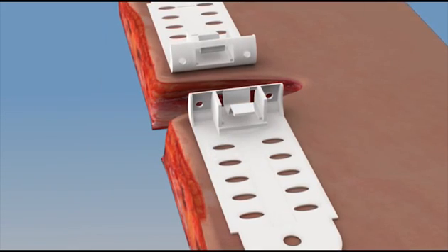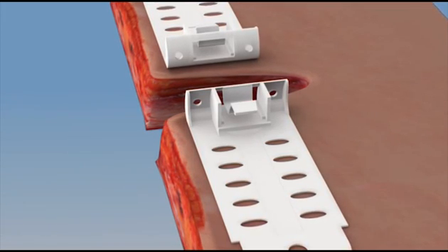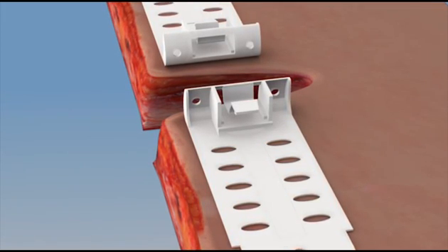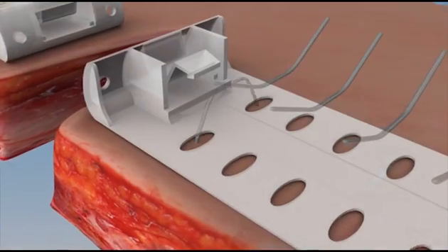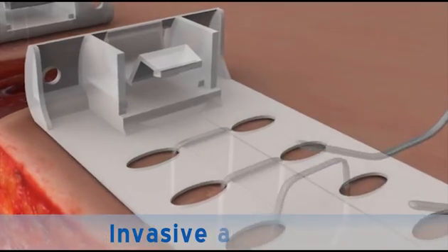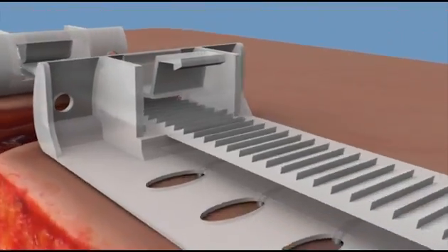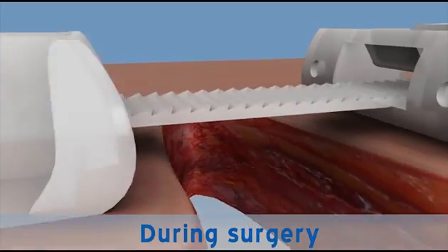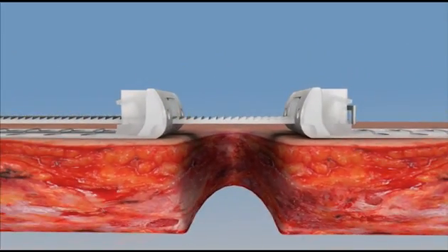The Top Closure 3S system can also be attached to the skin invasively using staples, sutures, K-wires or a combination of the above during surgery. The plates are secured to the skin by application of staples. The strap is inserted through the lock-release mechanism of one plate to the far plate. Here, the system is used for the gradual approximation of wound edges when the edges are under significant tension, preventing primary closure.